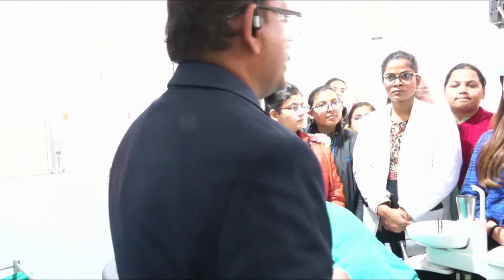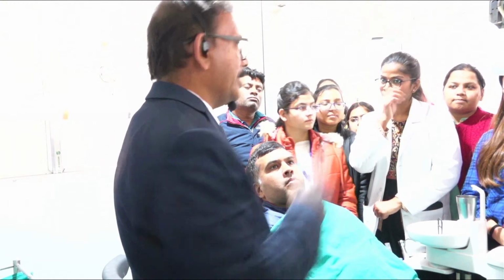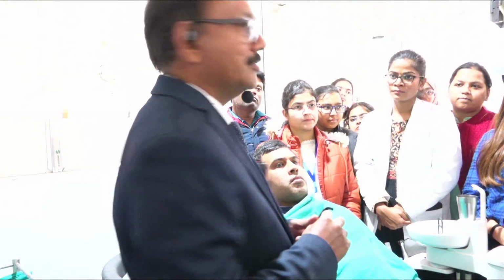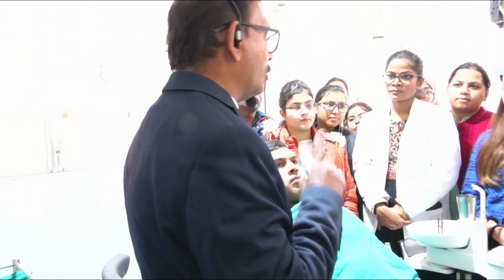Number of sessions for PDT in pocket, one session is more than enough, because the intention of us doing the PDT is elimination of all the organisms. You can't claim that only 50% of the organisms will be eliminated this time, the rest next time. So this IQ and general knowledge will start slowly making sense once you start using lasers, right? PBM you can do for chronic conditions at least 6 sessions. PBM, photobiomodulation, right?